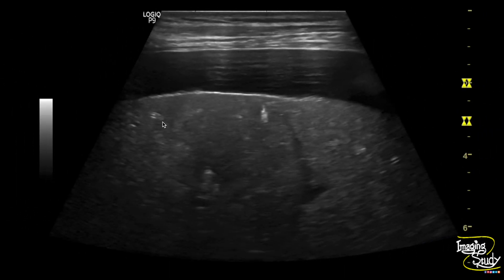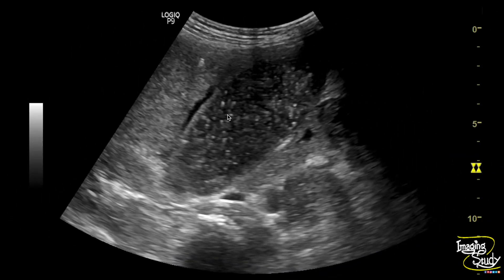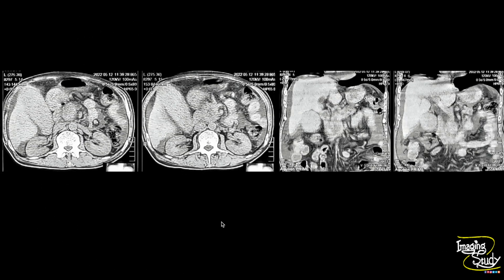Here again is the margin of the liver and you can see the ascitic fluid. Here is the picture of the gallbladder with internal echogenic foci casting comet-tail artifacts along with some sludge. According to CT, this gallbladder was completely filled with sludge.